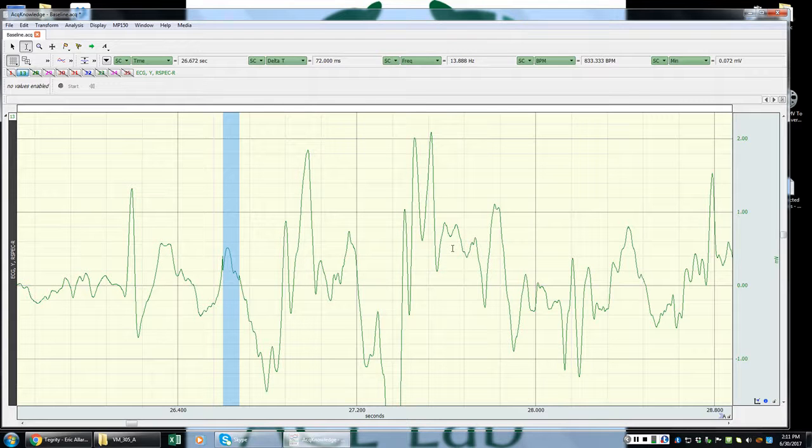Now what I want to do is a similar thing with this very tall wave here, which I think Acknowledge would want to identify as an erroneous peak. So I'm going to highlight that one again.